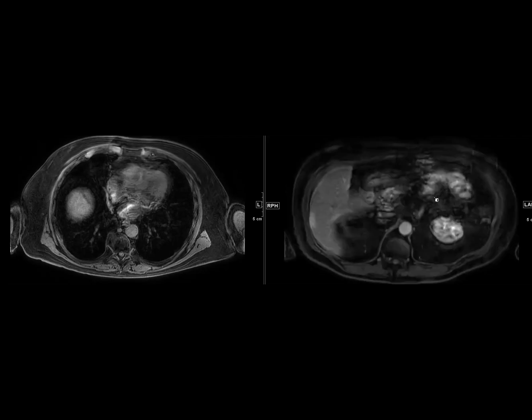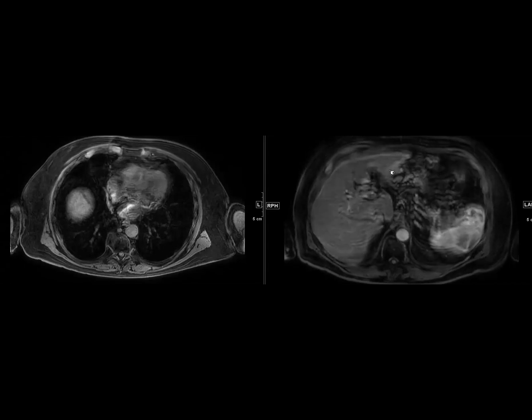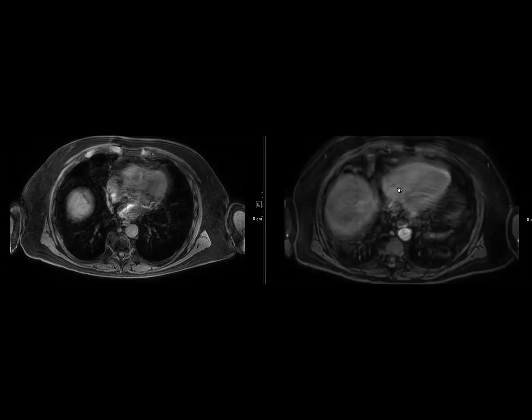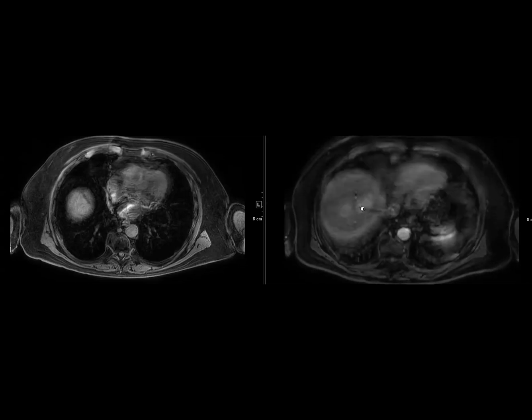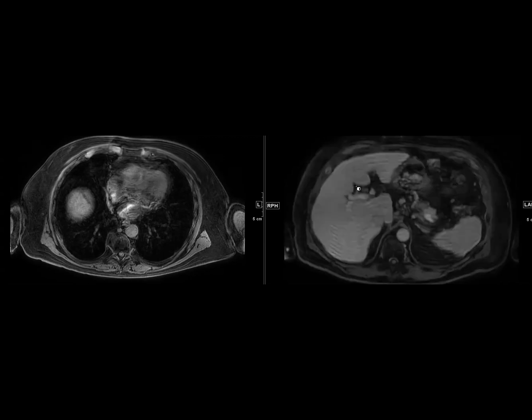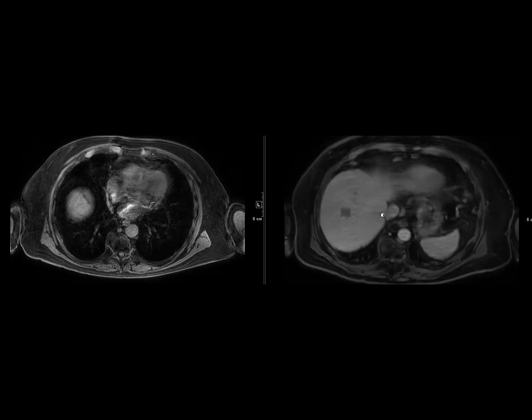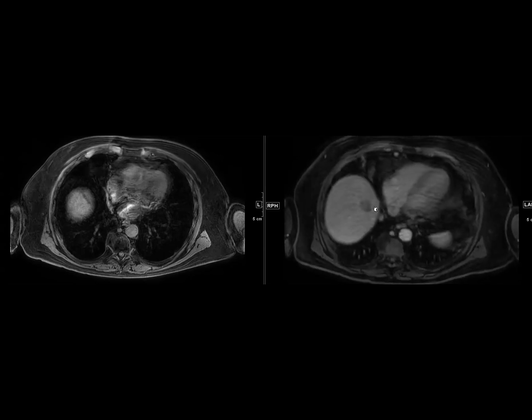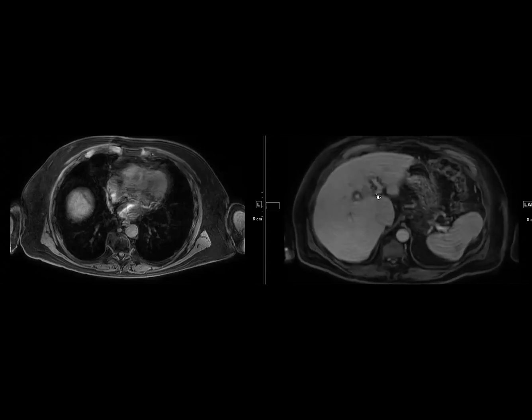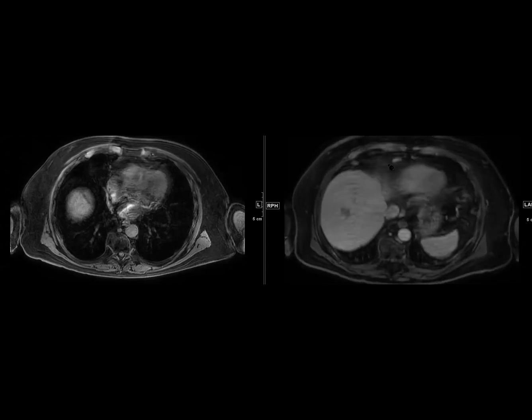who has a history of cirrhosis and lymphoma. And this is a scan from August. You can see that the patient really couldn't hold their breath very well, but even in arterial phase with all the motion, you can see these blobs of brightness, and these blobs of brightness wash out, and they're true lesions. You can see washout here, here, here, there, and there. So there were 5 LI-RADS 5 lesions, and because the patient had lymphoma, they weren't sure if they could just trust the imaging appearance.